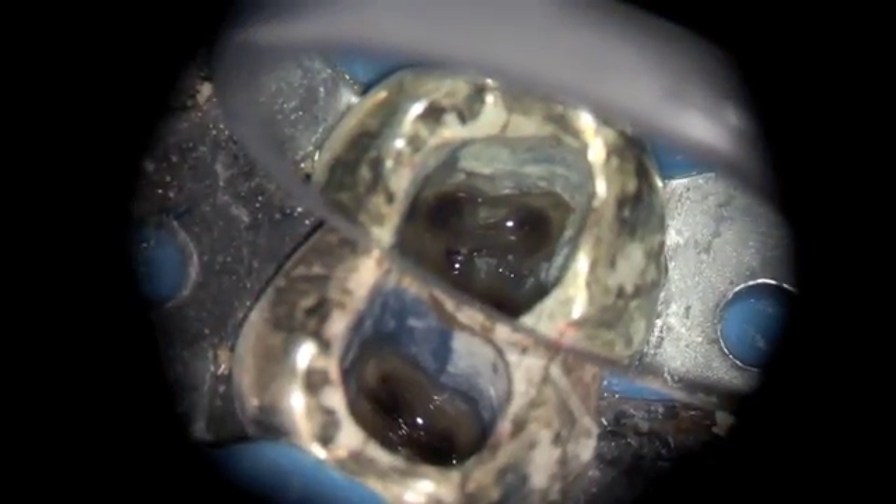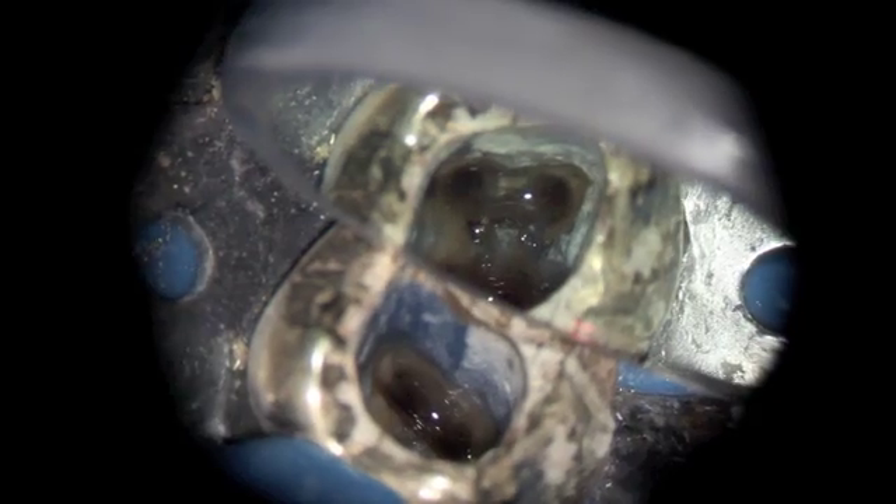You place the endo activator, you flood it with the chloroform, and you keep running it. Have your assistant place the endodontic suction tip on the distal portion of the crown, suctioning off the overflow as you inject a clear stream of chloroform. You can see with the pulp chamber completely flooded with chloroform, it is now clear and you see no remnants of gutta percha whatsoever.